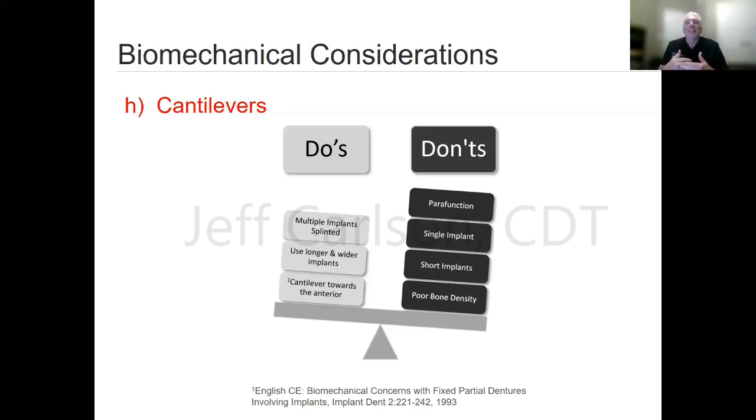Are you really setting this case up for the long term, or are you setting up for the propensity of a short term failure or fracture of the appliance? That's the other thing. Cantilevers are magnifiers of force. So it's not just magnifying the force, wanting to torque that implant in the bone, pulling on it, creating tension forces, but it's your prosthesis.